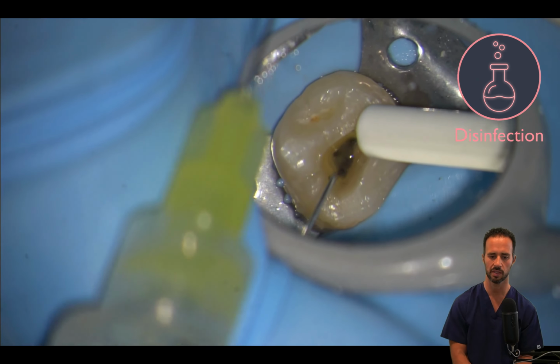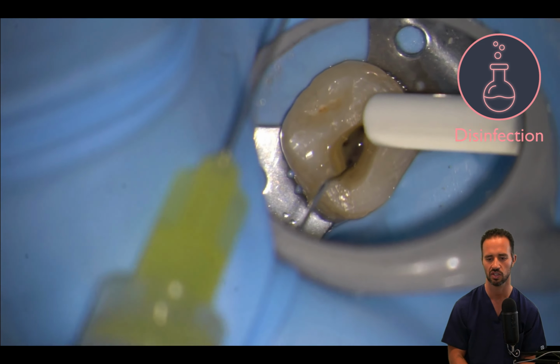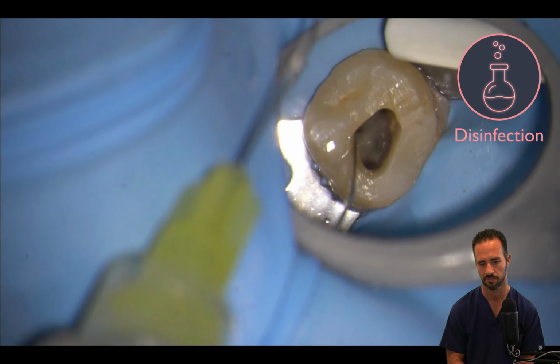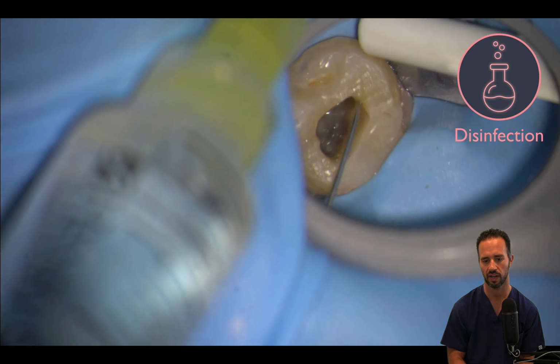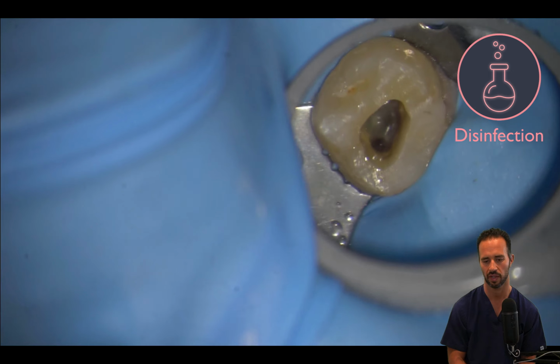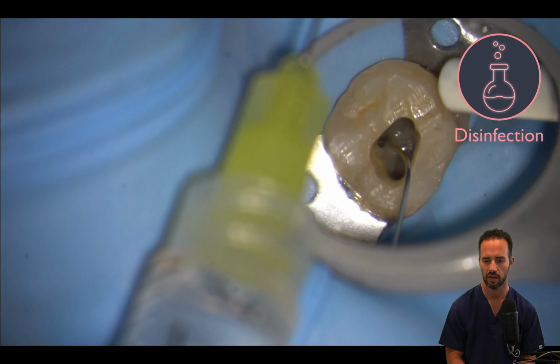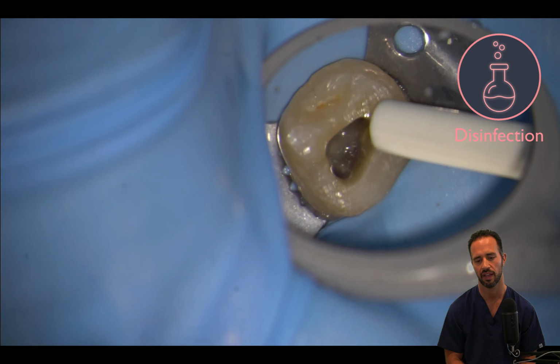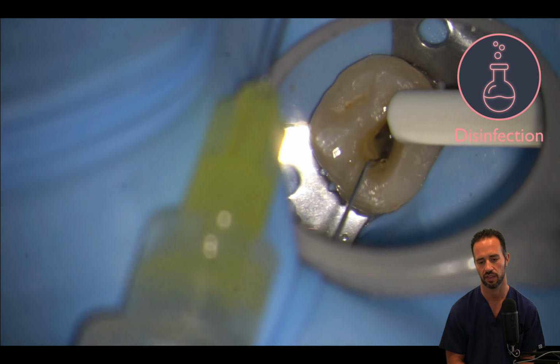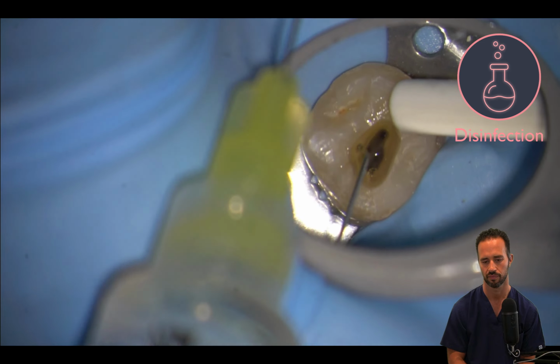All right, so at this point we've given up that there's an MB2 and we're proceeding into our disinfection stage, going ahead and passing all our sodium hypochlorite through the case. Good, then we're aspirating out in the 3 main canals. And we're going ahead and proceeding to our 17% EDTA. Then we're aspirating out our EDTA, and then we're going to move forward to utilizing our final rinse with our half-strength sodium hypochlorite. That's looking good.